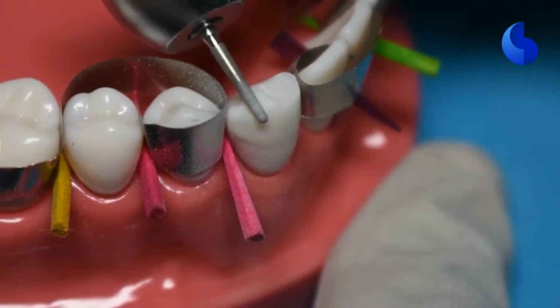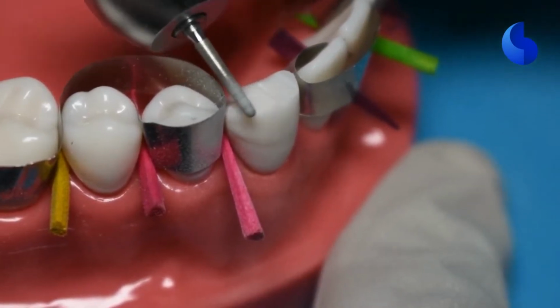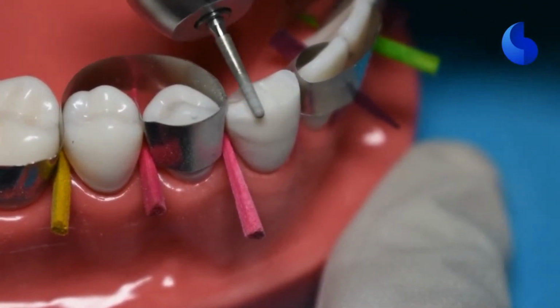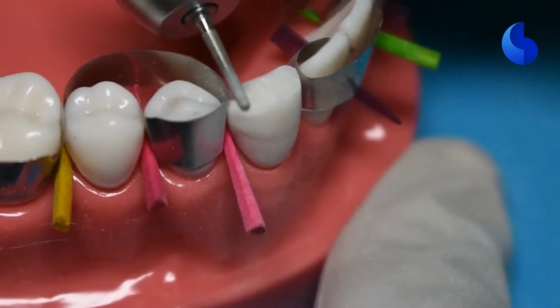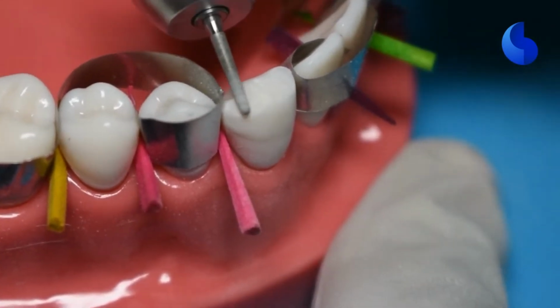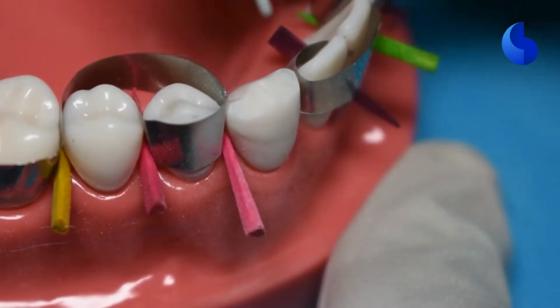And while you're doing this, since this is a canine, you have to ensure that you maintain the occlusal anatomy of this tooth. So canine does have one cusp, so we have to make sure that we have that. We continue to preserve that instead of flattening it out.